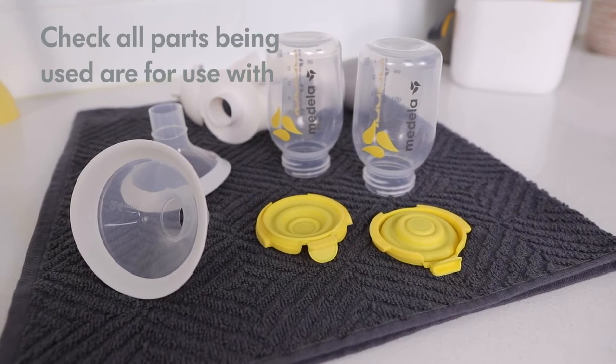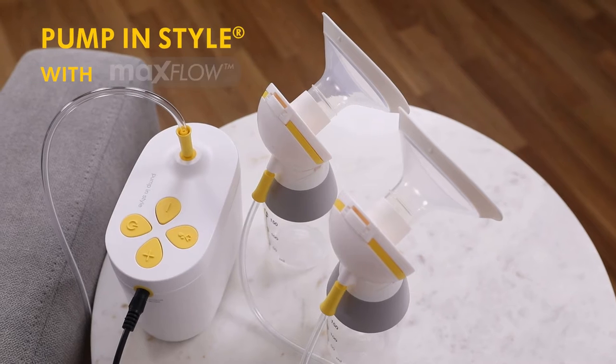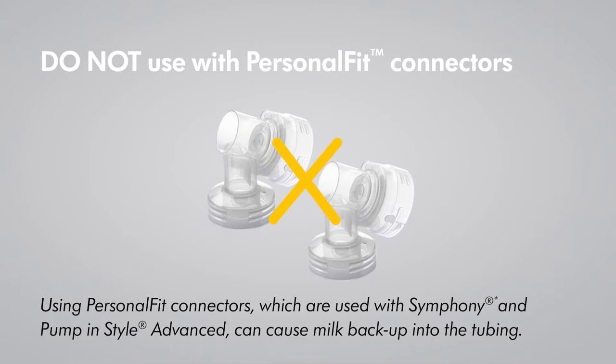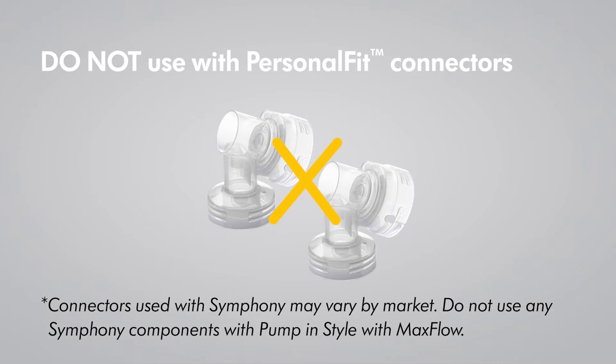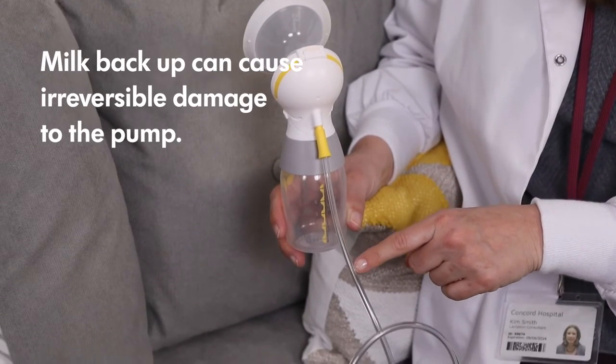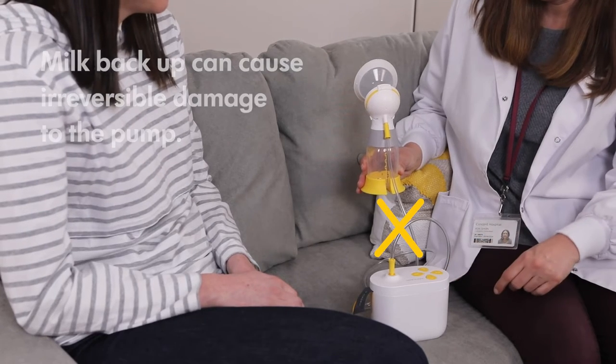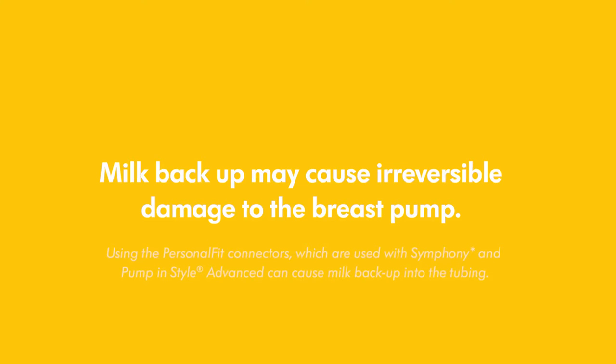First, check that all parts being used are for use with Pump and Style with Max Flow. Next, ask mom if milk has backed up into the tubing at any point. If yes, contact Medela Customer Service, as milk backing up into the pump may cause irreversible damage.